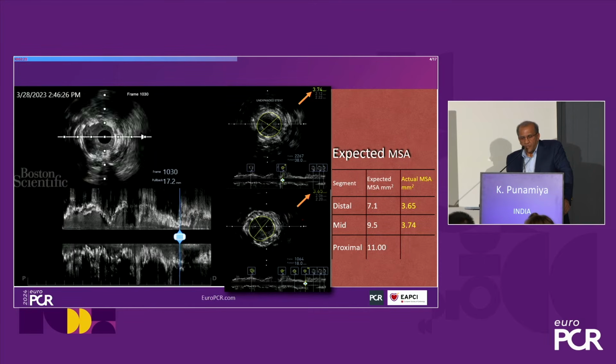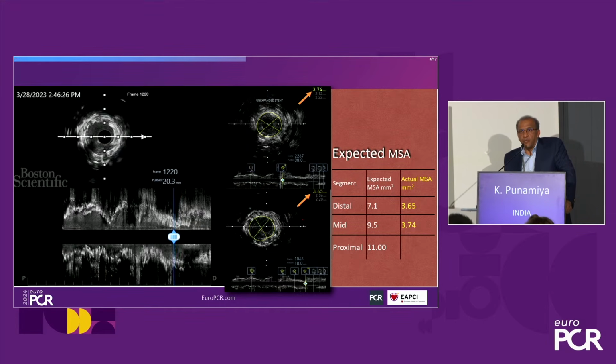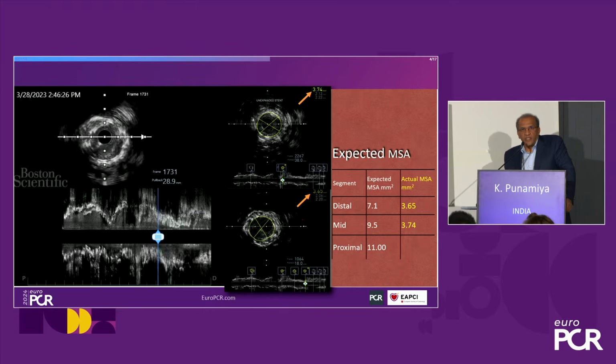So you can see those 2 images there of severely underexpanded stents in spite of the high-pressure 3.0 balloon dilatations that they did at 25 atmospheres. So this is a serious underexpansion of stent in an area where an attempt has been made with a very high-pressure balloon. And the beauty of this laser is that it allows us to assess this without distorting this expansion index. That means if you were to use a balloon, you wouldn't be very credible about your underexpansion because it would have expanded that area a little bit.